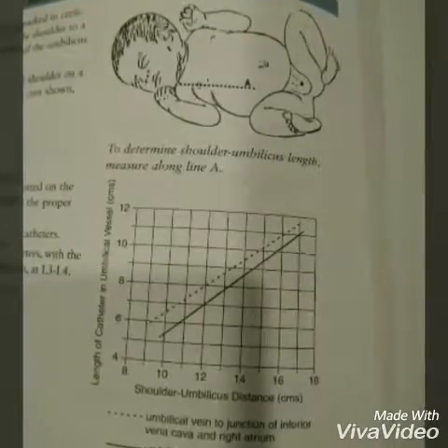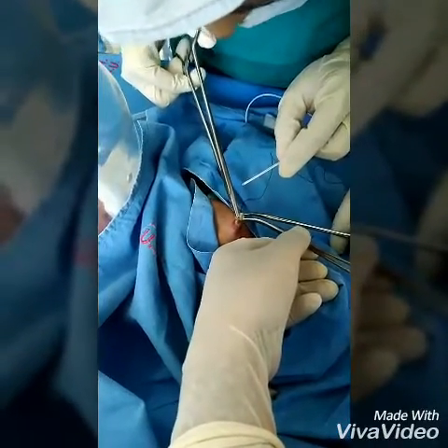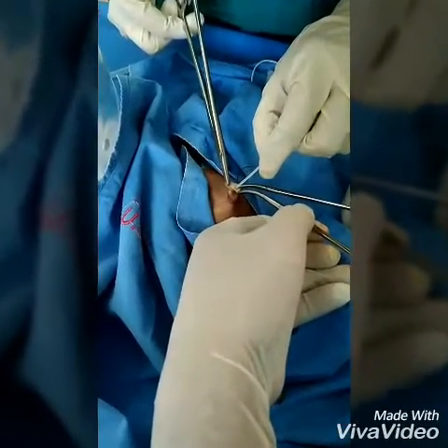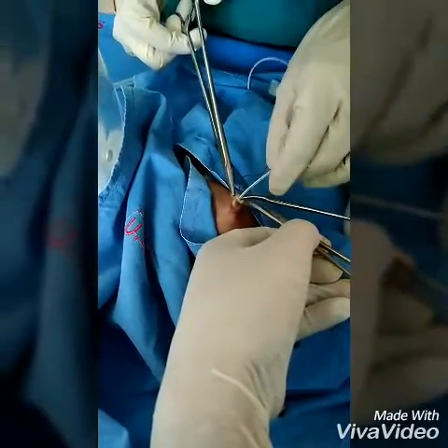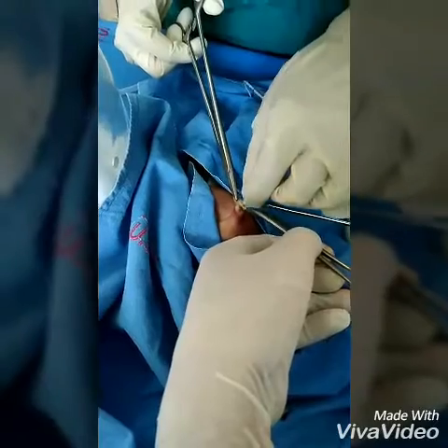We have to first measure the shoulder-umbilical length and then measure the umbilical venous catheter length on the graph. A stump of at least 0.5 centimeters should be left for suturing.